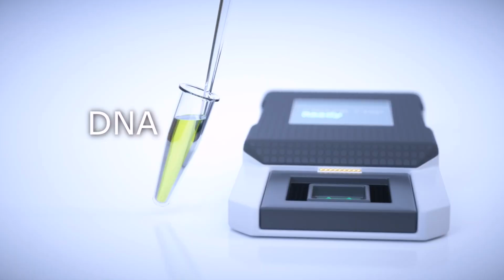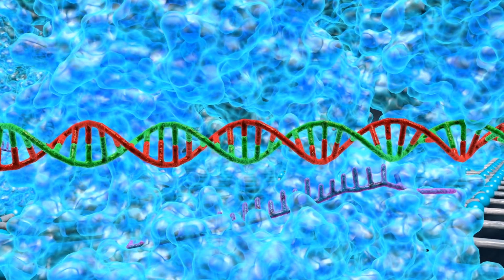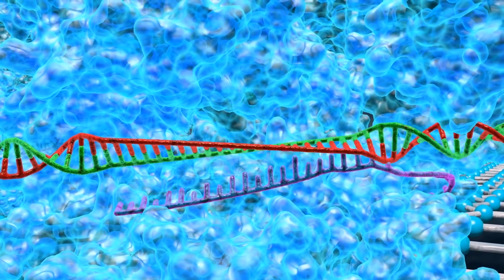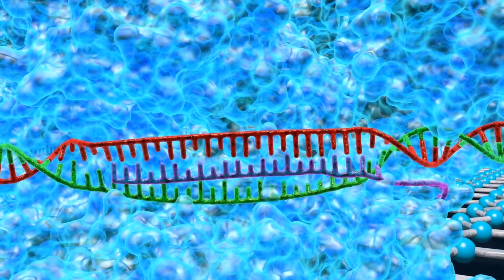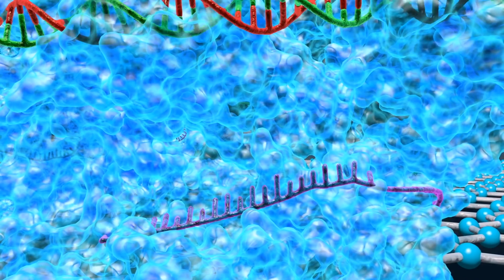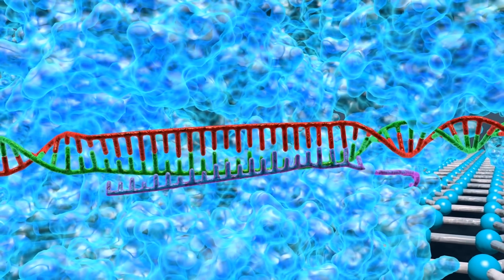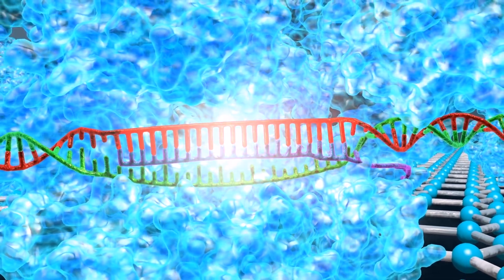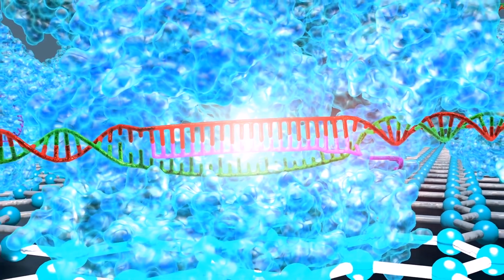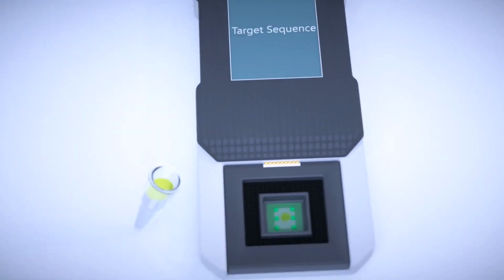We introduce the DNA from the patient on top of the graphene surface in CRISPR-Chip. The CRISPR scans these DNAs. If CRISPR doesn't find its target gene, it won't bind to it, and the DNA is released. But if it scans and finds its target, then it'll bind to it. Then this binding will create an additional charge on top of the graphene surface, and this can be sensed with CRISPR-Chip.